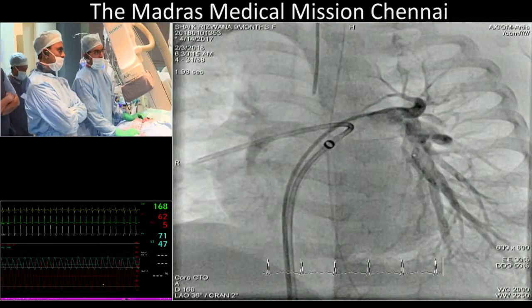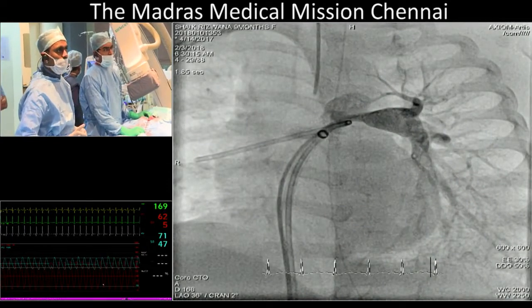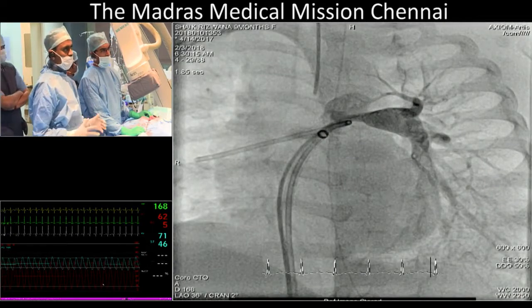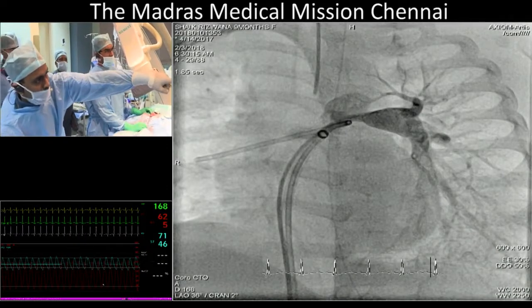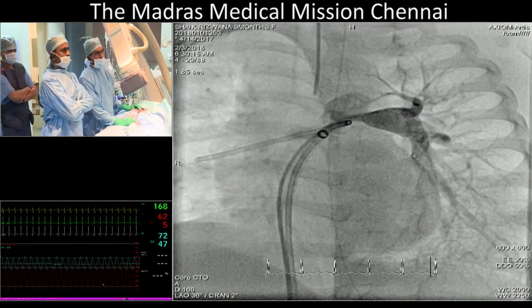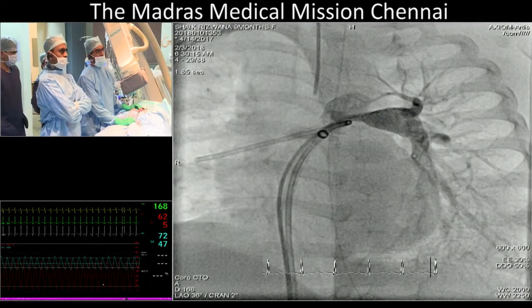For the Williams, I think you would need more than systemic right ventricular pressure to want to intervene. You want super-systemic pressure and maybe good evidence that the RV is in trouble and suffering. The failure to thrive is likely to be the Williams, unless he has definite right heart failure requiring diuretics. So if you were going to do it, I guess a plain balloon on the left to start with and a cutting balloon on the right.